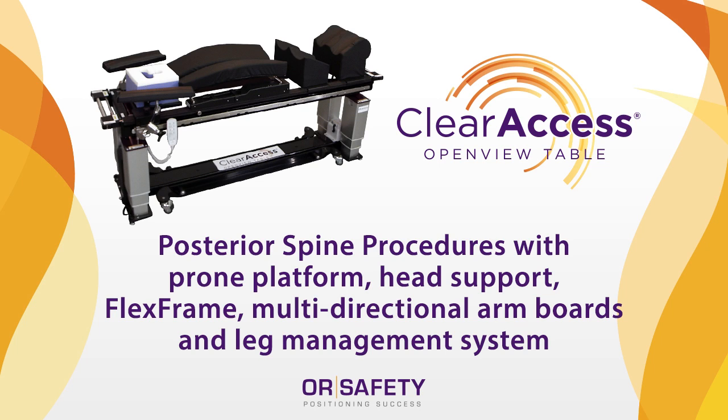This setup is most often used for posterior spine surgery procedures such as decompression, laminectomy, discectomy, fusion, osteotomy, vertebroplasty and kyphoplasty.